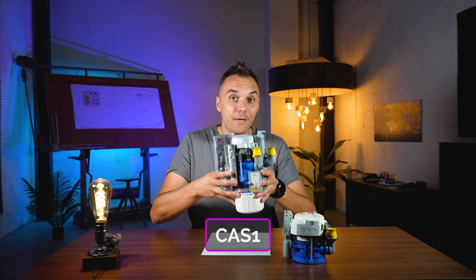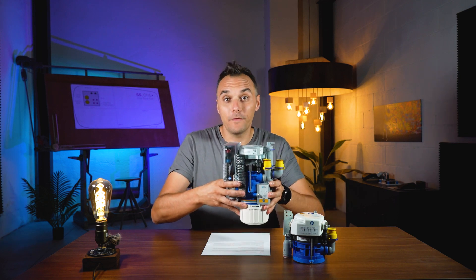When we need to use these valves, it depends on the suction system that you have and whether you need to do an amalgam separation or not. They are very similar in name but very different in practical use, because the CS1 is only used for air-water separation, while the CAS1 is used for air-water separation, amalgam separation, and some other features. The CAS1 is the big brother of all the Durr valves.